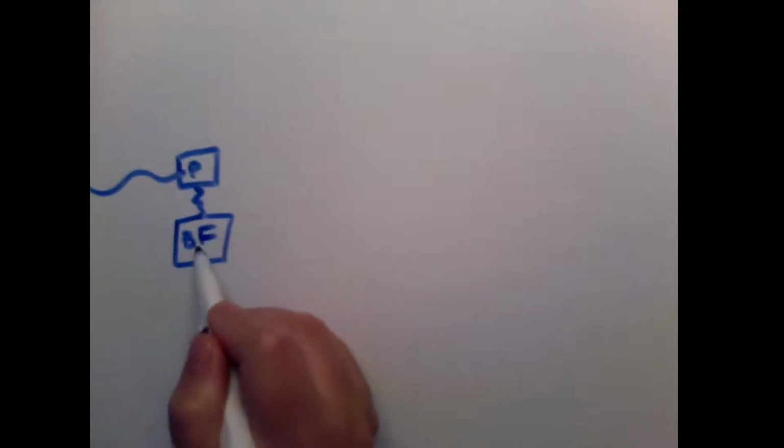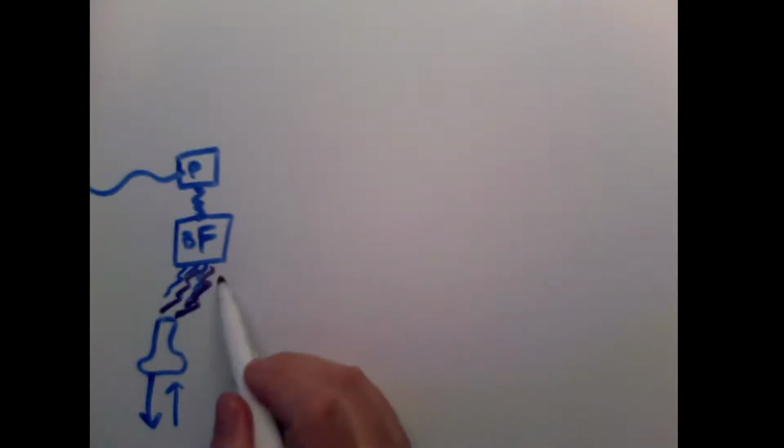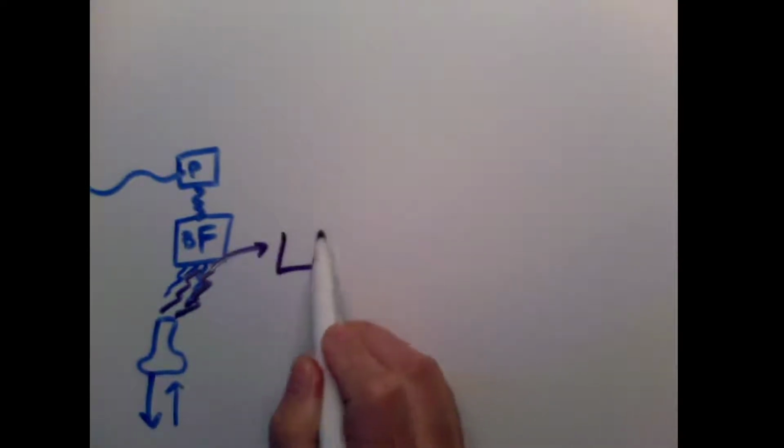And the beamformer is only necessary in pulsed echo machines. It's not necessary in continuous wave machines, but beamformers have to be in our pulsed echo machines, because the beamformer is going to be the thing that creates all those patterns to steer the beams around. So the beamformer is going to get the voltage, and it's going to decide the pattern that goes out to our transducer. The transducer then is going to send sound into the body, and then it's going to get some sound back. The transducer then is going to send a voltage back to the beamformer, and the beamformer is going to do a little bit of processing, but for the most part it's all going to go over to the receiver.